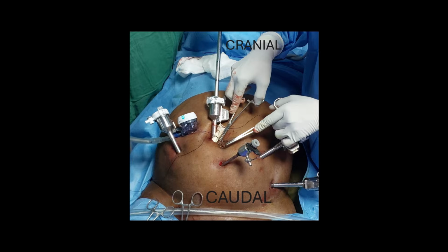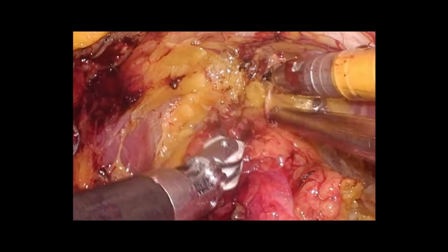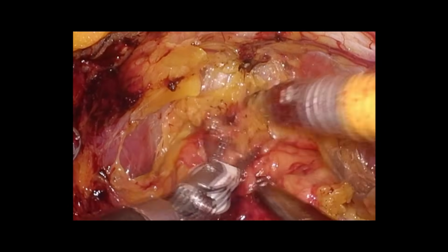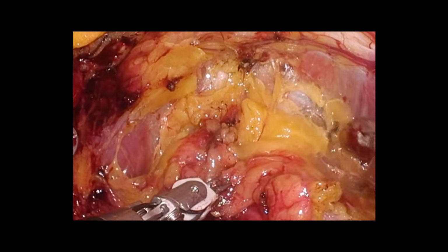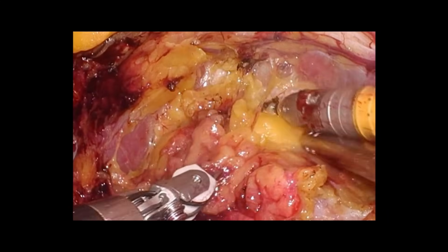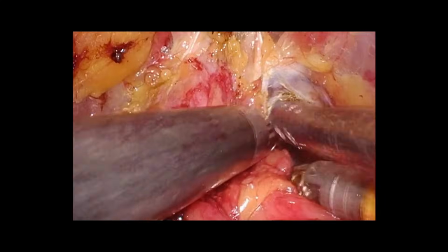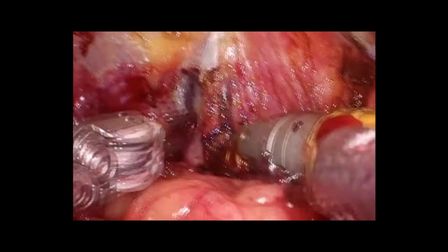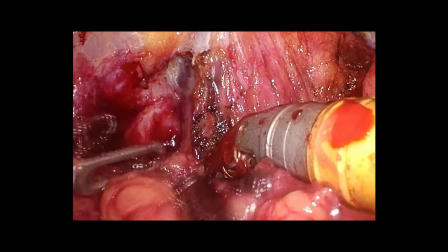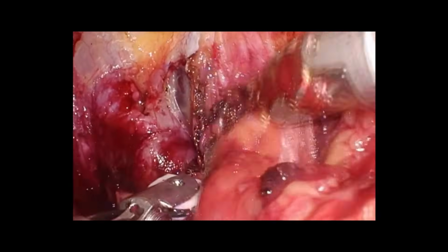Make sure that while placing the assistant ports, it is better to keep the patient in the Trendelenburg position, a little more steep, so that the bowel is not in the nearby vicinity. Especially on the left side, the chance of injuring the sigmoid has to be taken care of. Once you enter, you defat the anterior wall, then the procedure becomes easy, like a transperitoneal approach. In this case, it's a small prostate, a post-TURP case.